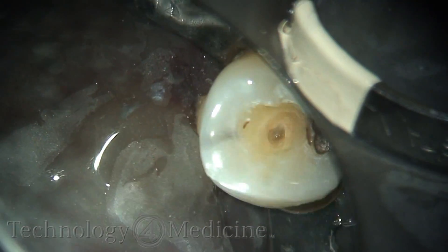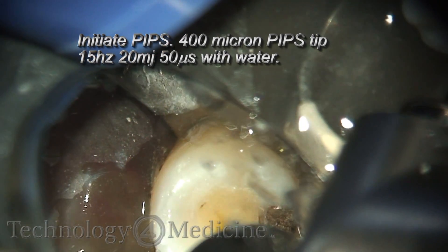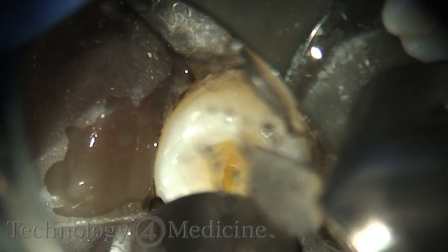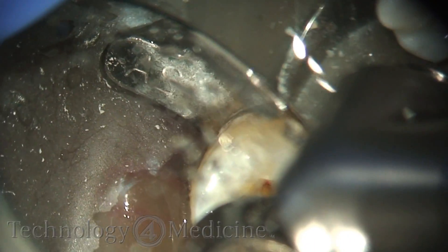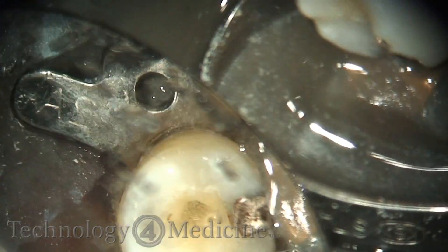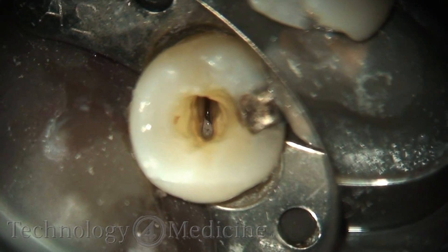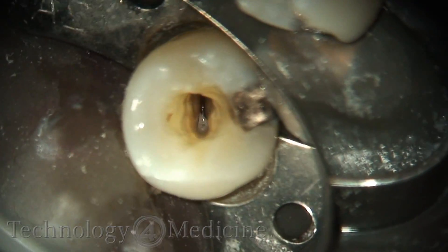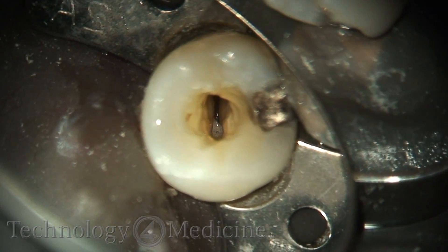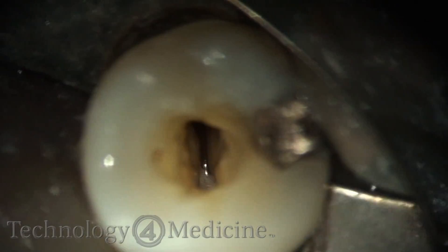I know you're dying for me to answer this question: was the patient anesthetized? Most of the time when I'm performing endodontics, unless I know the case is extremely non-vital, I will anesthetize because there could be some vital tissue in those lateral canals and I don't want the patient to experience that. Can you do this without anesthesia? Yes, you can. When I performed PIPS for the first time, what he experienced were the pulses of photon-induced photoacoustic streaming of the fluid. He could feel the pulses in his entire mandible, being amazed that at such low energy settings he could experience that — even being anesthetized. I gave him a mental block, by the way.